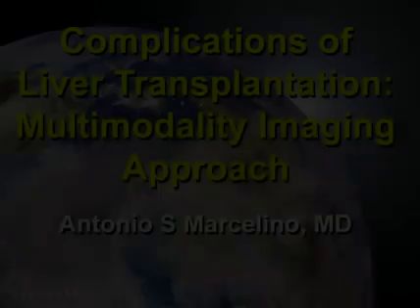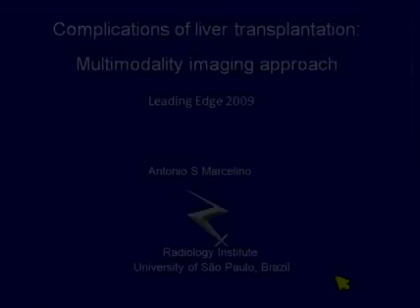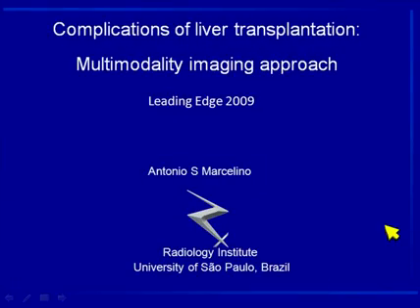I will talk a little bit about complications of liver transplants, normal and pathologic findings, and a multimodality imaging approach. Complications of liver transplantation, multimodality imaging approach. We're going to see some usual and unusual cases of complications of liver transplantation.